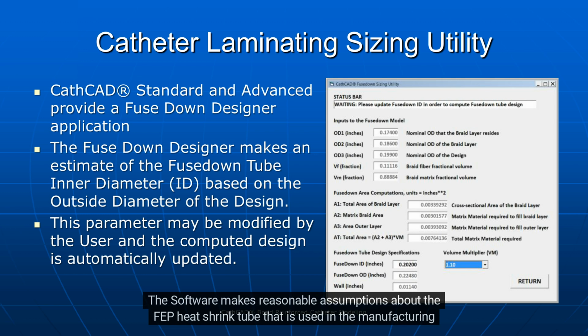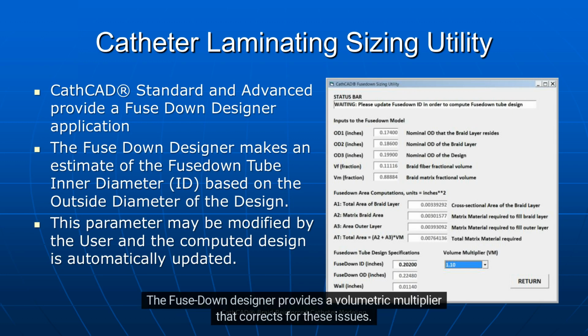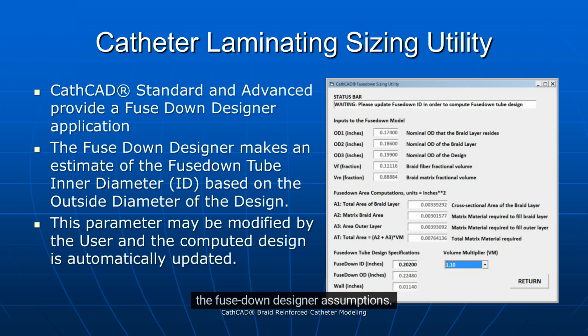The software makes reasonable assumptions about the FEP heat shrink tube that is used in the manufacturing process. Gross departures from this assumption will result in a low or high product outside diameter. The fuse-down designer provides a volumetric multiplier that corrects for these issues. The volumetric multiplier is a parameter that may be set by the designer to correct for departures from the fuse-down designer assumptions.